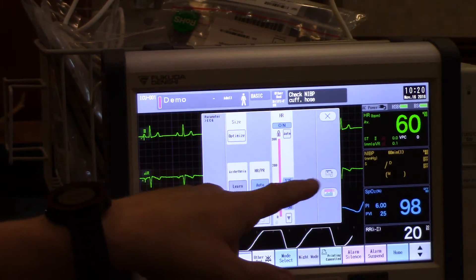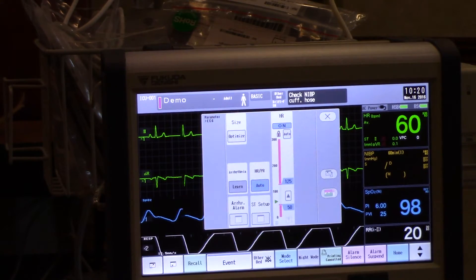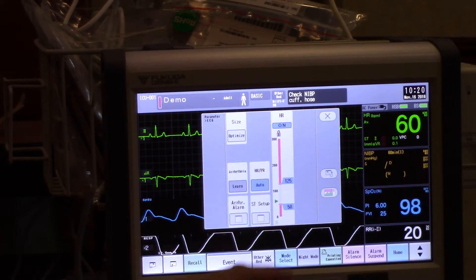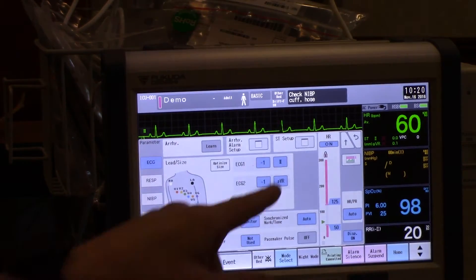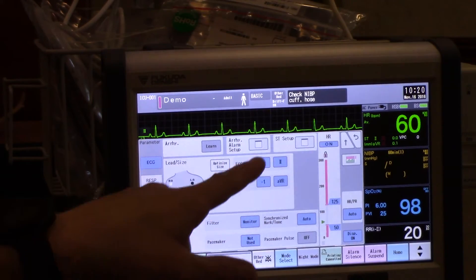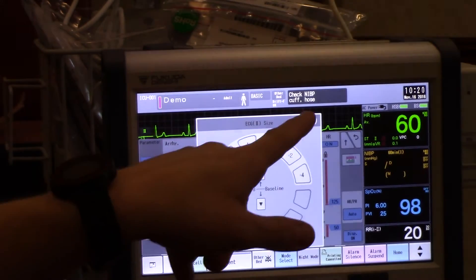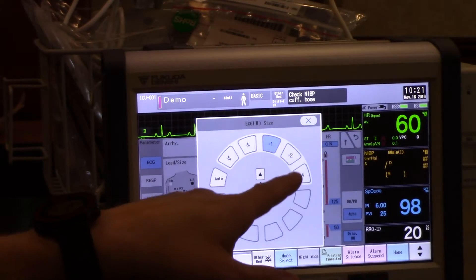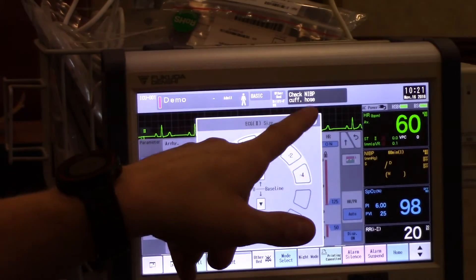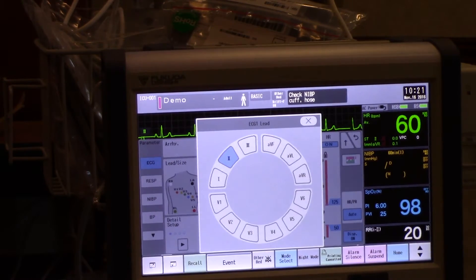The second screen — there's a picture-in-picture button on the right of your menu. If I press that screen, from here I'm able to change my gain, the size of my ECG waveform, as well as my lead.